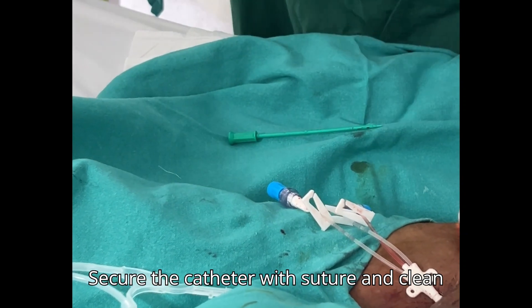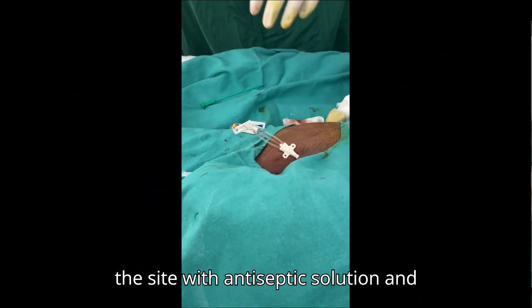Secure the catheter with suture, clean the site with antiseptic solution, and place a sterile dressing.